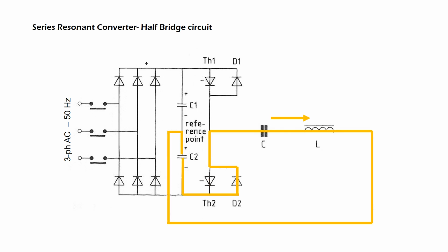When the current crosses zero, thyristor TH2 stops being conductive and the current is taken over by diode D2. Now the thyristor TH1 can fire again. This procedure can be repeated as frequently as desired.